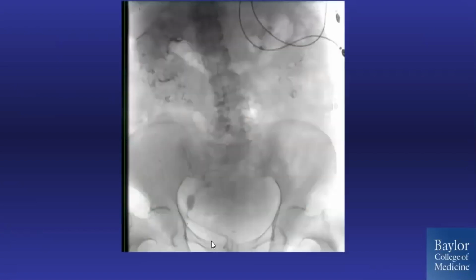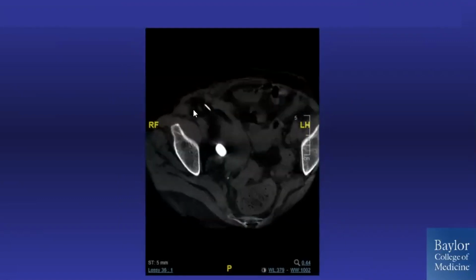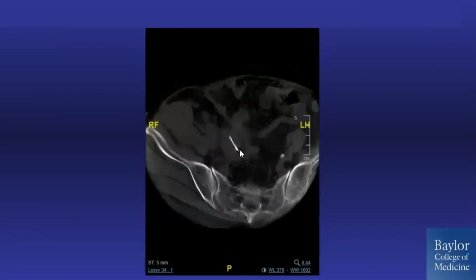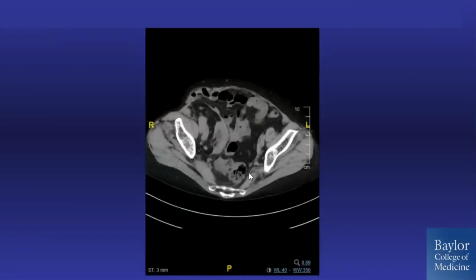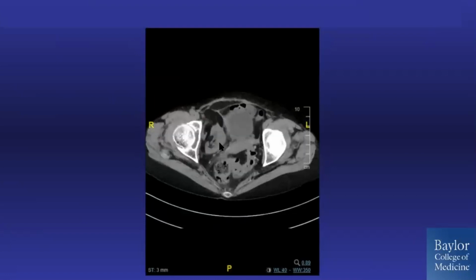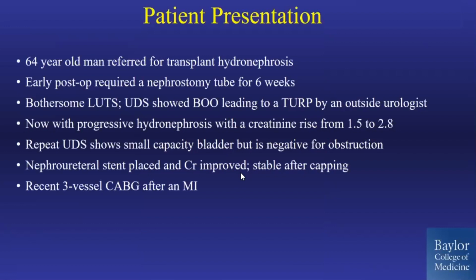So I stented the patient, and I found a very brave interventional radiologist who somehow was able to find some sliver of a window by some bowel here into the kidney. And this is the post-op from percutaneous management. It was all done with a flexible scope. There was no getting a rigid scope into this kidney. But you can see we cleaned that kidney out pretty good. So this is a favorable outcome.